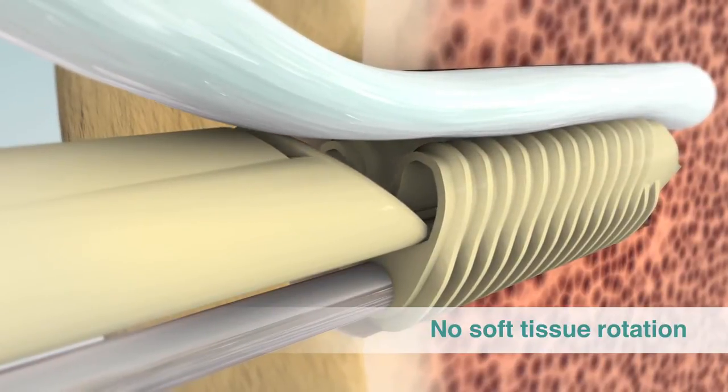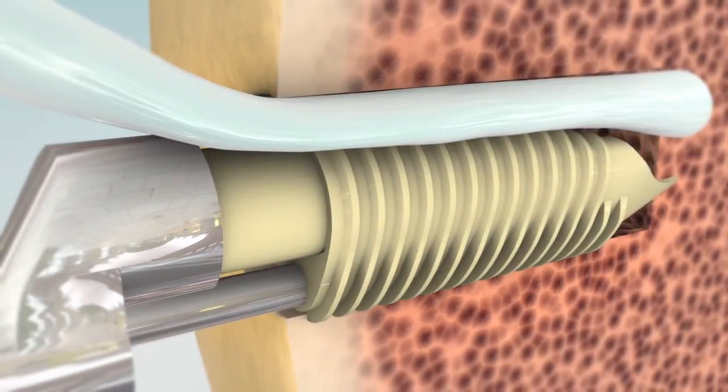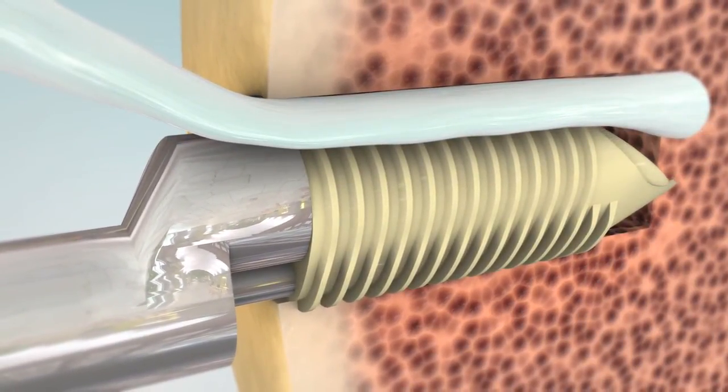Unlike interference screws, Eclipse does not exert any rotational force, allowing surgeons to maintain their desired soft tissue orientation.